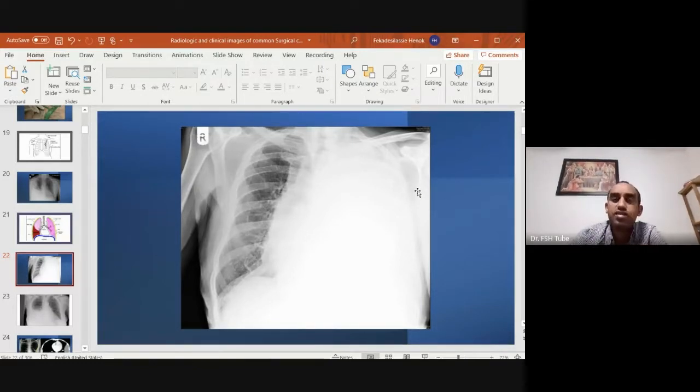If you see something like subcutaneous emphysema, definitely that is blood, right? For example, a fracture, subcutaneous air, or a clavicular fracture. Those are clues to tell you that it could be blood. Some people might challenge you, what do you think, could it be blood? Then if you see a fracture, yes, I think it could be blood because most probably it's related to trauma. Otherwise, the other differential diagnoses can still be entertained.